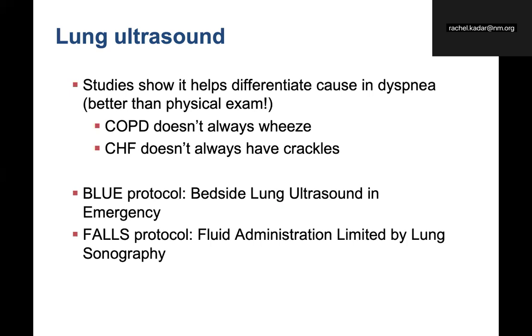Two common protocols that I like to use that use lung ultrasound are the BLUE protocol and the FALLS protocol. The BLUE is the bedside lung ultrasound in emergency, and the FALLS is the fluid administration limited by lung sonography. I recommend that you take a look at both of these protocols.